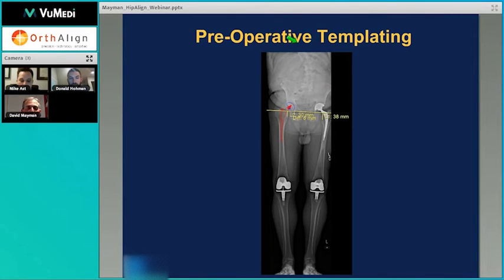And then I just do my standard preoperative templating like I would do in any case. But now, because the patient is positioned lateral in a functional position, so they're laying just on their side, but their spine is doing the same thing as it's doing here. Their pelvis is tilted the same way as it is on this image.